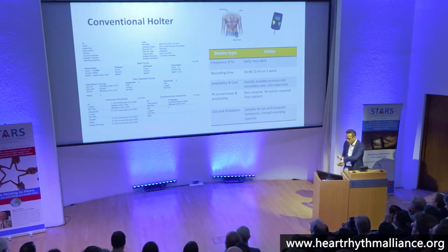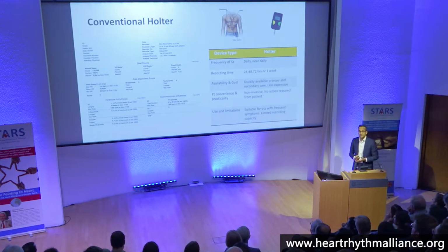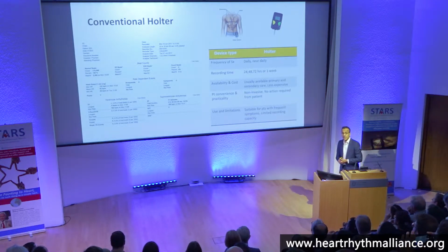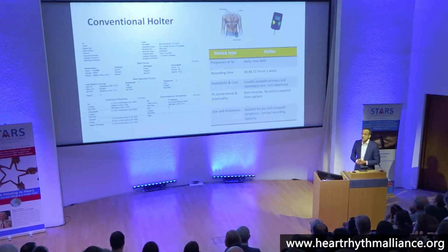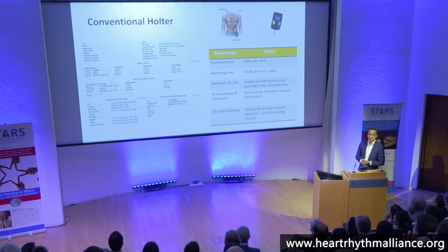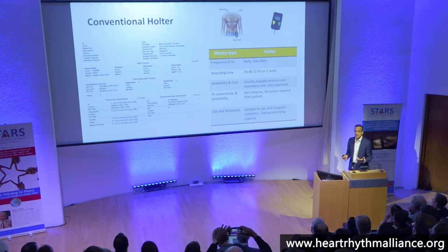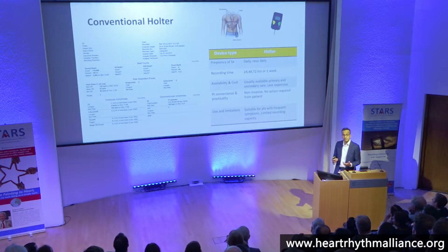The conventional Holter, this is probably the most ubiquitous monitor, and by virtue of the fact that it is so ubiquitous and it's been around a long time, it's relatively cheap. They run for 24 hours, 48 hours, 72 hours, and up to 7 days. The advantage is that it is continuous recording.